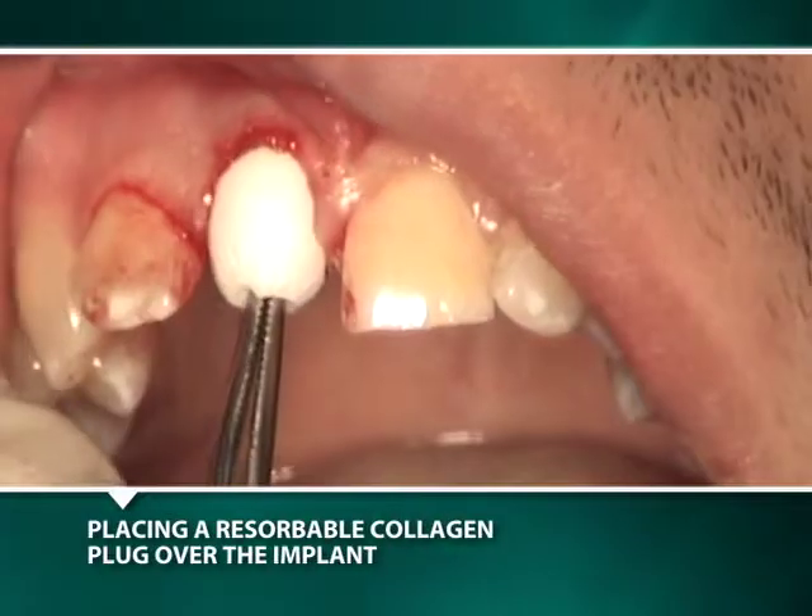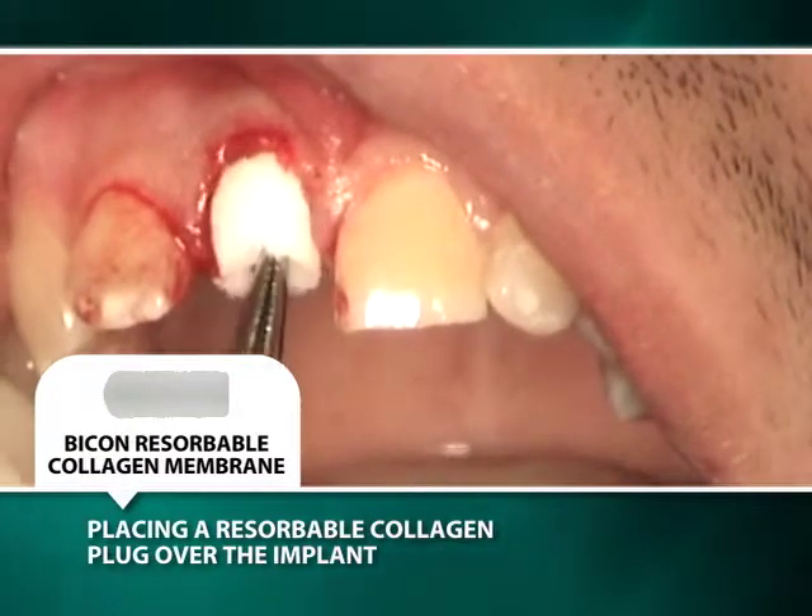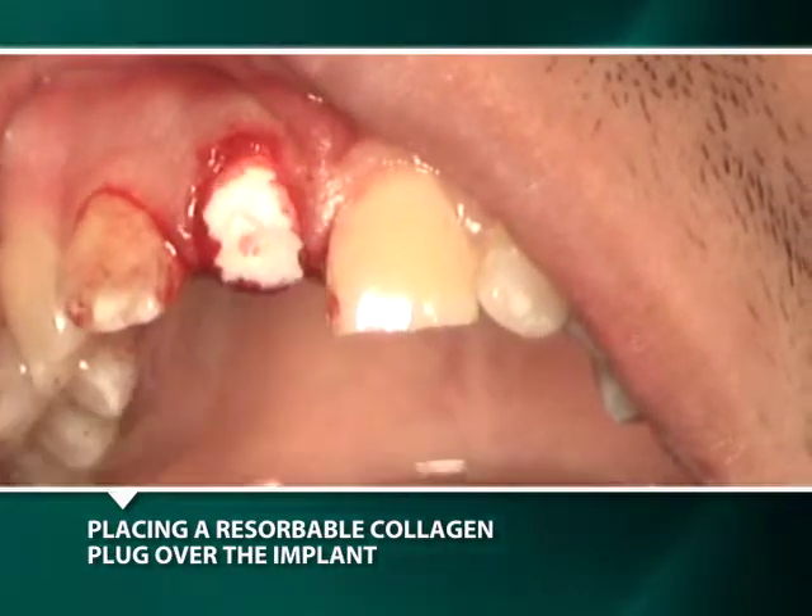Harvested autogenous bone is placed over the implant and a resorbable collagen plug is sutured in place to bridge the soft tissue gap.